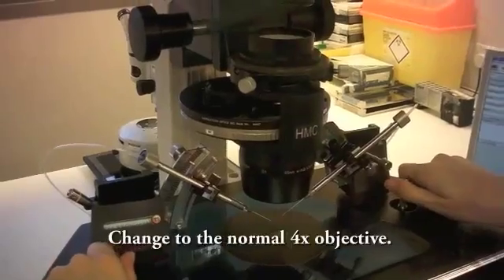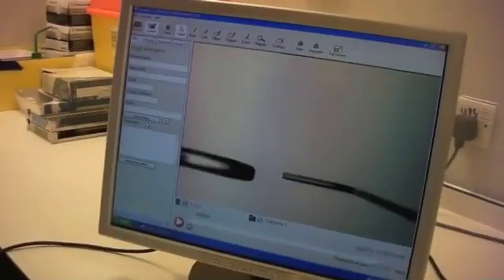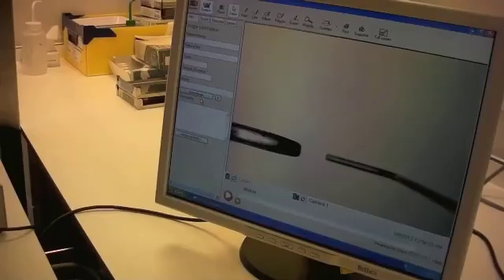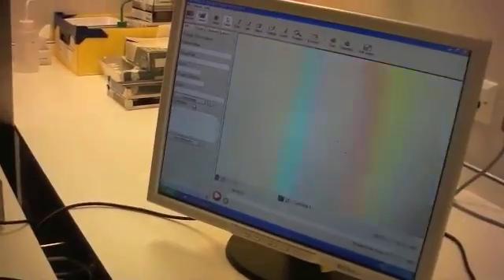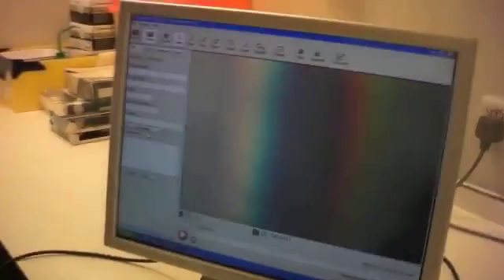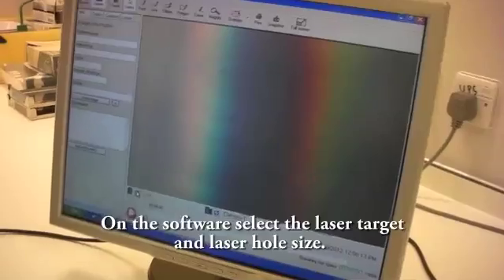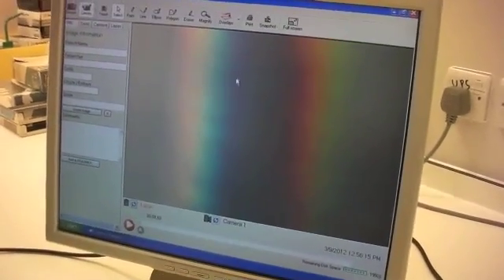Change to the normal four times objective. On the software, select the laser target and laser hole size, then add the single disc target.